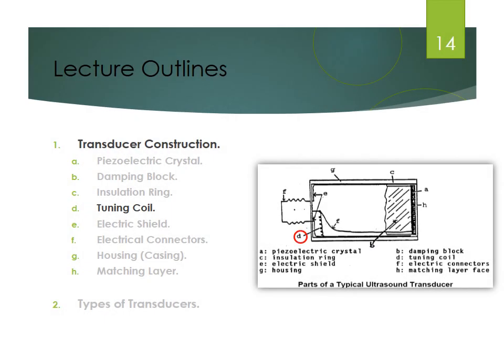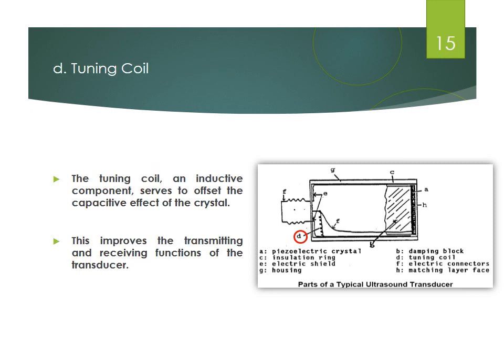The tuning coil, an inductive component, compensates for the crystal's capacitive effect. As a result, when the tuning coil compensates for the capacitive effect of the crystal, the transducer's transmitting and receiving functions improve.